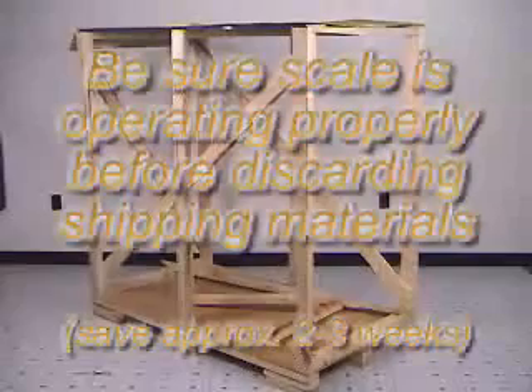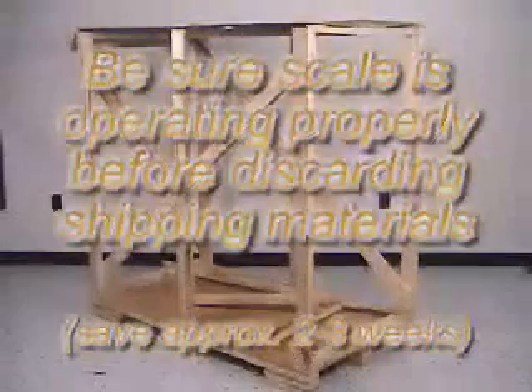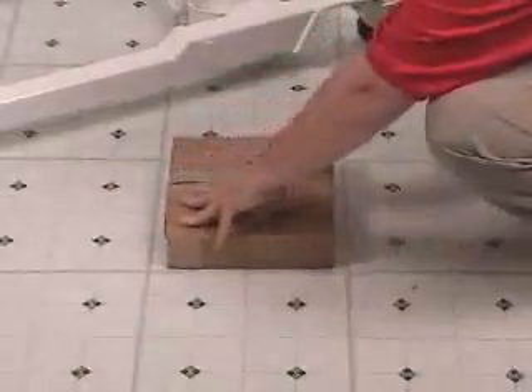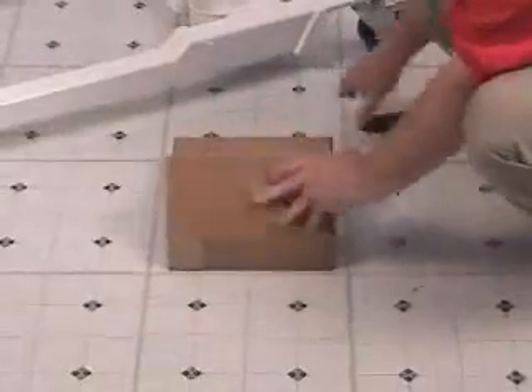Once again, be sure to save the crate, boards, and packing material for a while until you are sure the scale is operating properly and there is no need to return the scale to the factory. Now it's time to open the small box that was set aside earlier. Open carefully with the pocket knife.